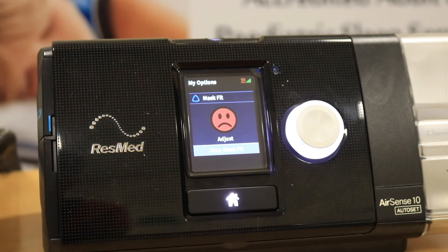I'm going to tighten the head straps. That has corrected the mask leak and a good seal is back on the display.